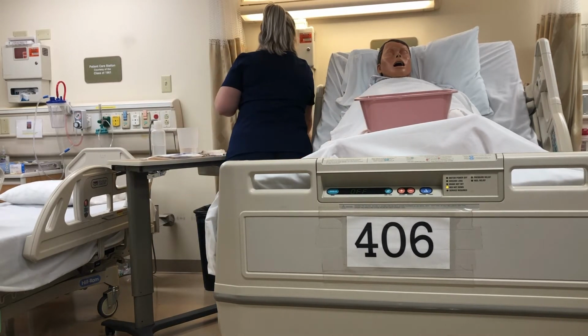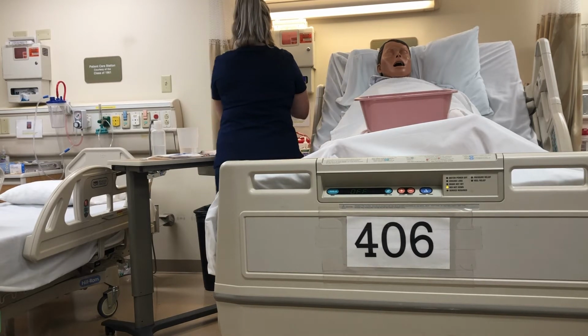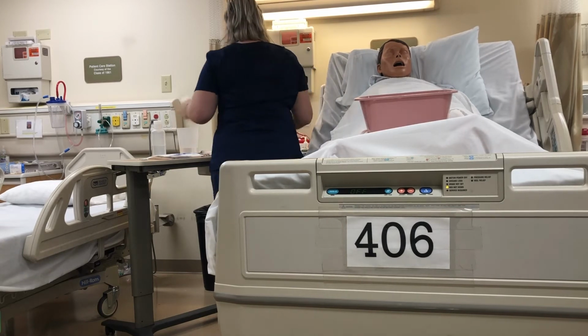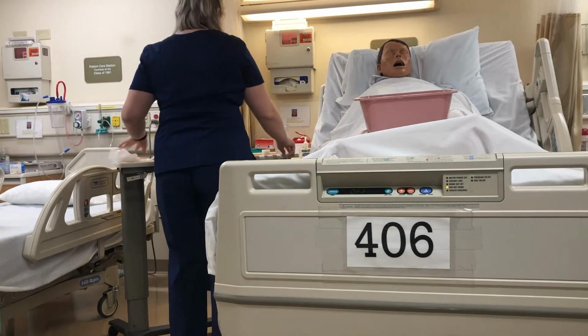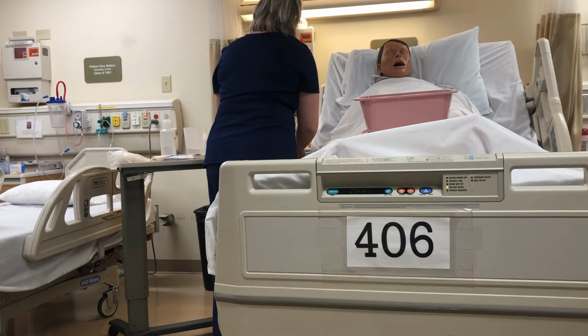Okay. So I'm going to wash my hands again and put some gloves on. And actually I'm going to just put a few pieces of tape on my workstation here.